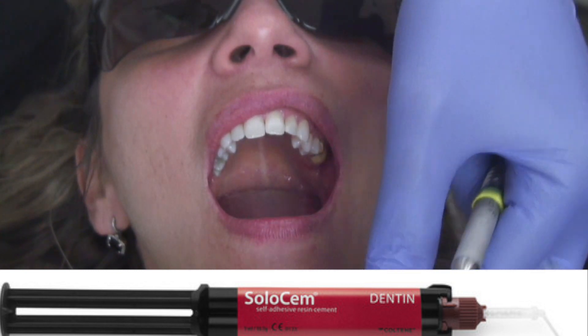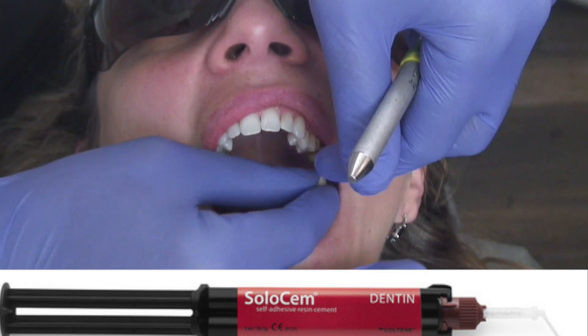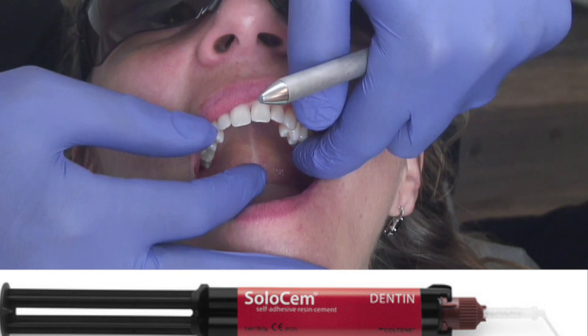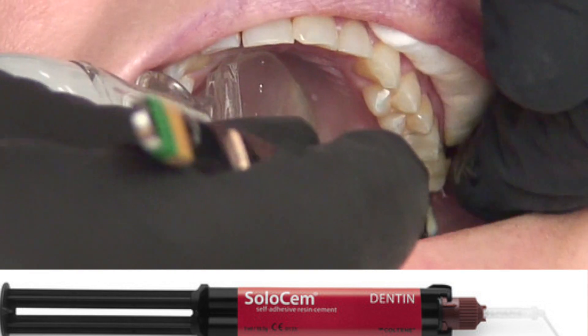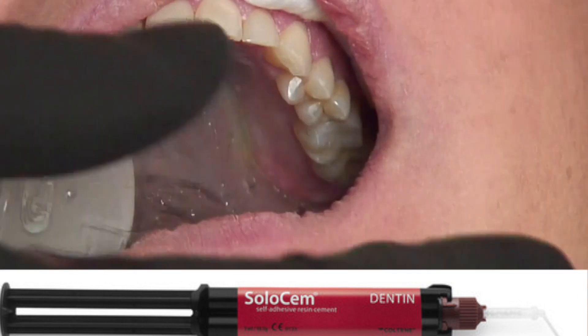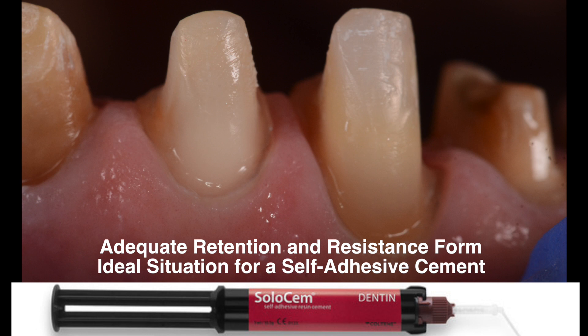Solosem is indicated across a broad range of clinical situations, such as cementing crowns and bridges, root posts, inlays and onlays, as well as on implant abutments. With its high radiopacity and low shrinkage, Solosem can be used predictably where the clinician feels that the ease of use provided by this cement is more convenient than achieving the highest bond strength possible.